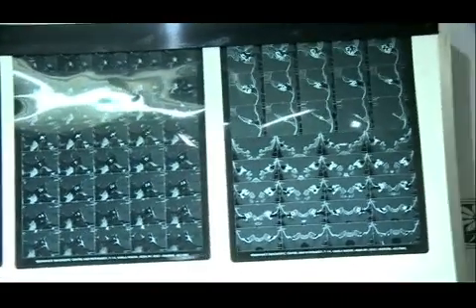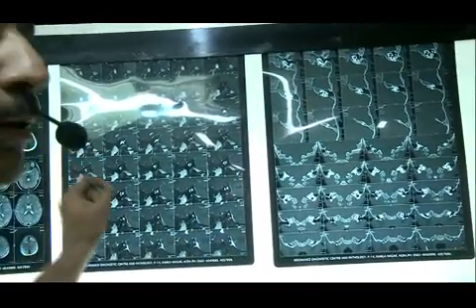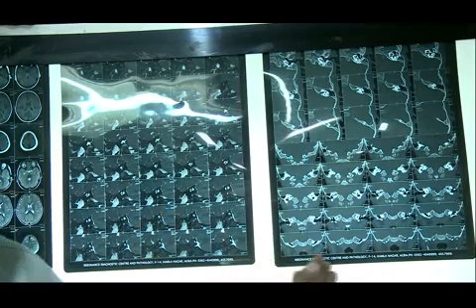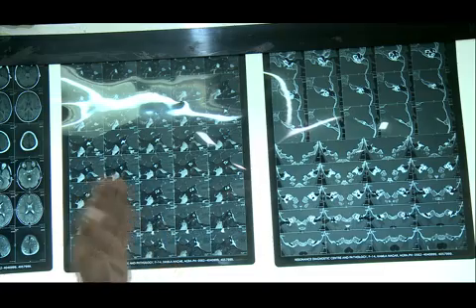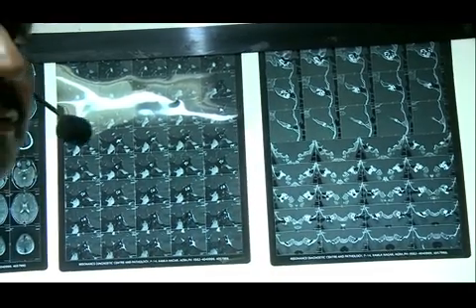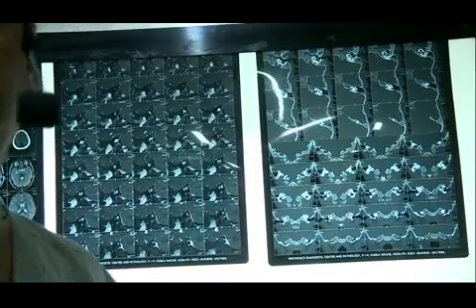What we need to see on radiology is that nothing which precludes cochlear implant surgery is there, like the lumen of the cochlea and the presence of the cochlear nerve. These are the two most important things to be seen on radiology, and that is best depicted by MRI. Another thing to see in radiology is the anatomy of the ear or the temporal bone where we are putting the implant, so that we know whether there are any anatomical situations which can complicate our surgery.